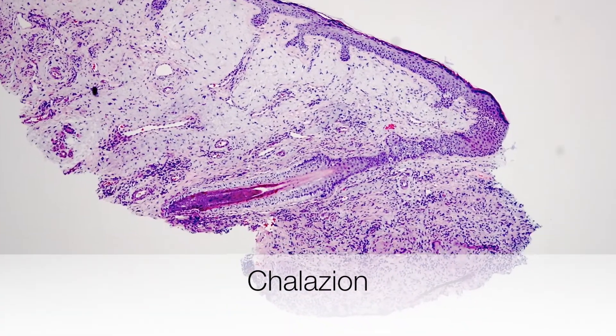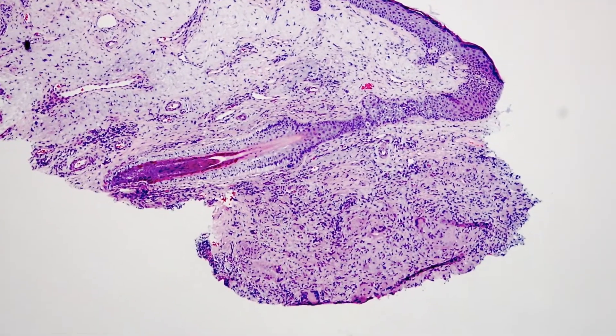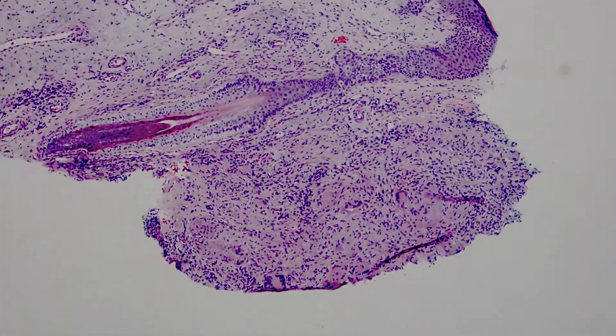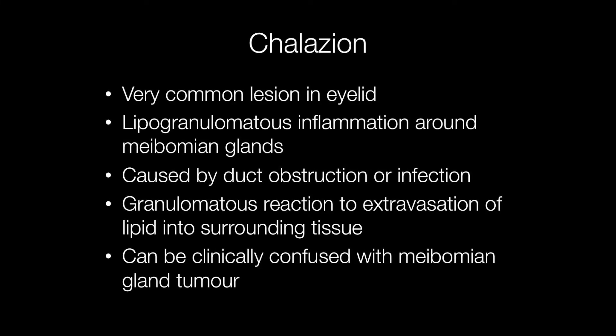This is a biopsy from an eyelid containing a chalazion. Chalazions are very common lesions that occur in the eyelid, and they arise as a result of a blockage or infection of the duct of a meibomian gland, resulting in extravasation of lipid into the surrounding tissue, and this causes a granulomatous inflammatory reaction.